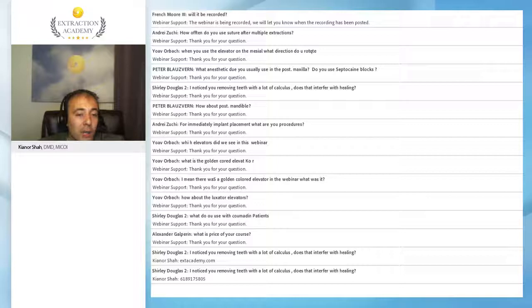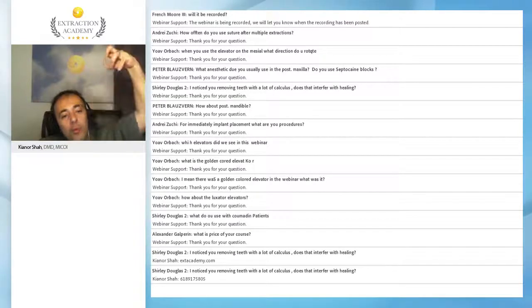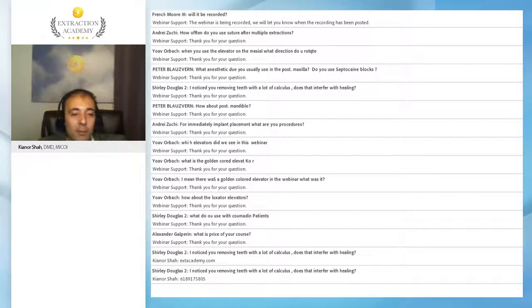For immediate implant placement, I spend all of my energy and focus, all of it, on the buccal bone. I start with the mesiodistal. If there's a root that's underneath my bone, I have to trough just enough to get, either with the root tip elevators or a straight elevator or a curved elevator, just enough so I can see if I can flick that tooth out. There are some instruments out there where you drill down to the nerve canal of the tooth and engage the tooth and move it out of the socket. I haven't had much experience with that, but they do exist.